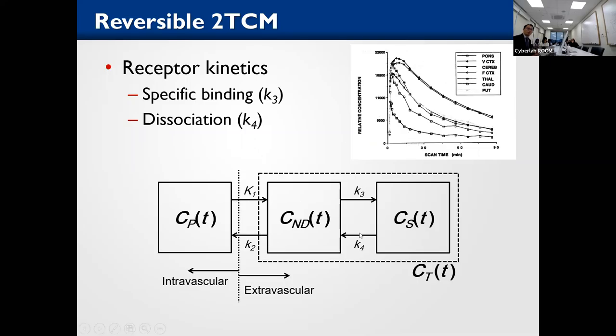And using this limited time resolution, we cannot follow the fluctuations based on these four parameters. We cannot distinguish the fluctuation from noise and the fluctuation from four parameters. Four parameter curves fluctuate very sharply, but we cannot distinguish. So we only apply three or two parameter models to the PET data.